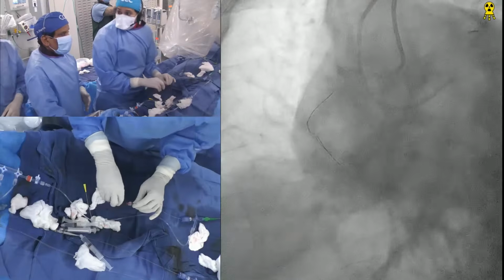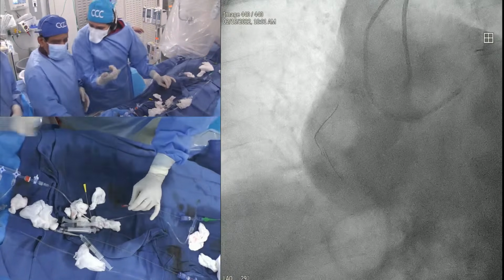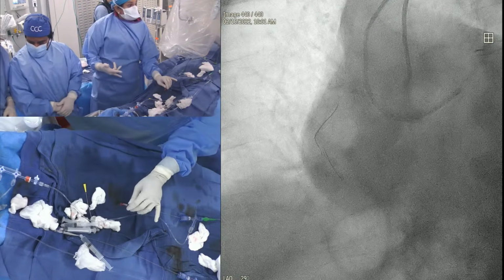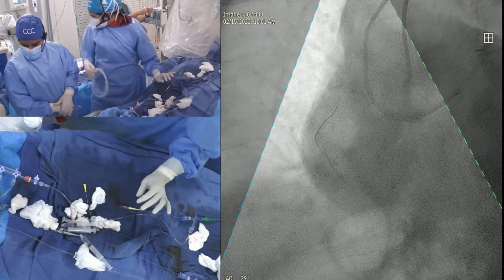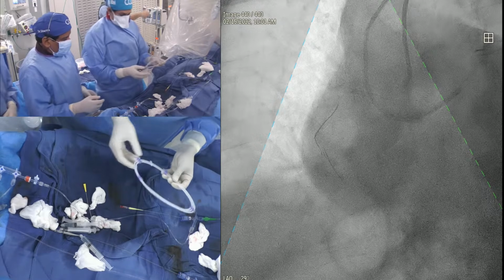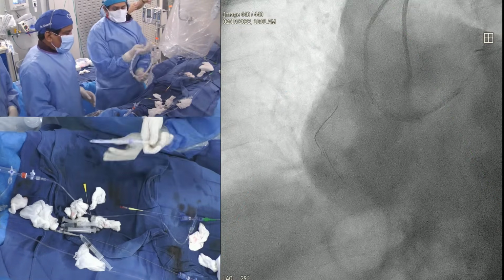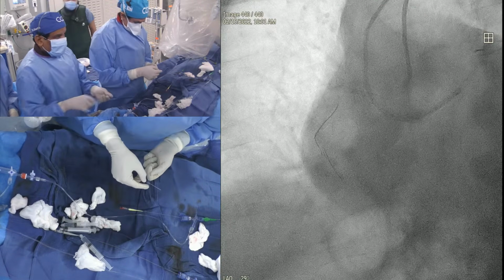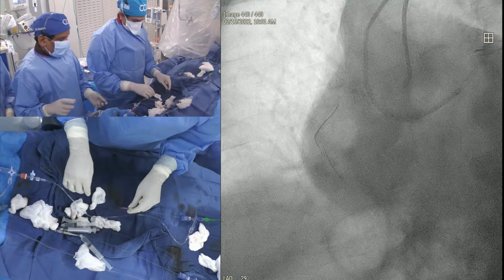Confiance at 12, quickly. That's really the last one. Something happened, we don't know. Fluoro change. Okay. So we still persist a little and make that connection between our antegrade wire and the knuckle of the retrograde wire, which is not able to advance any further.